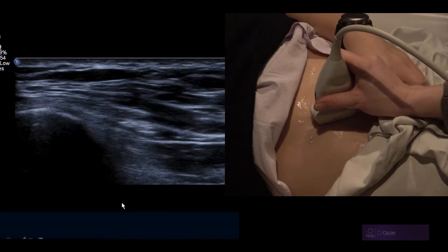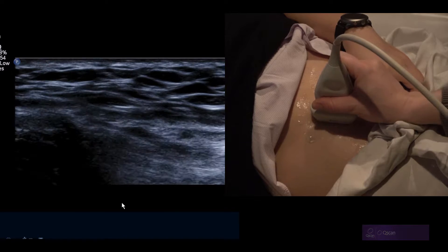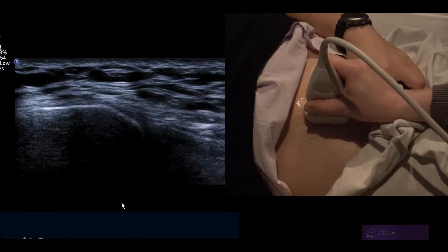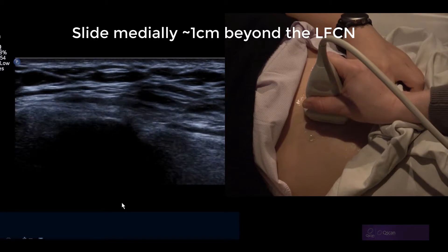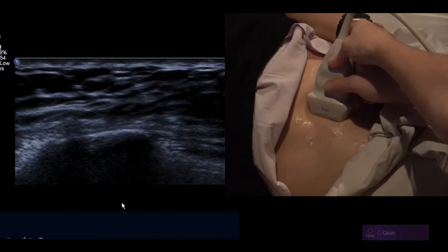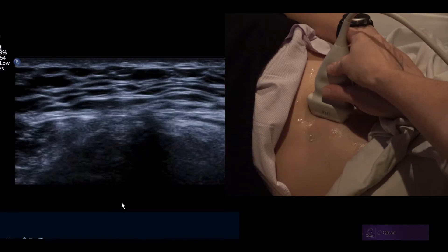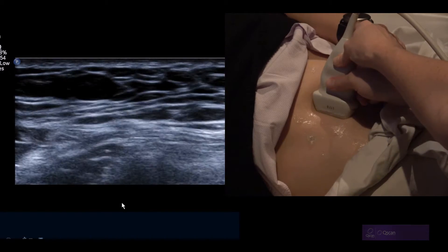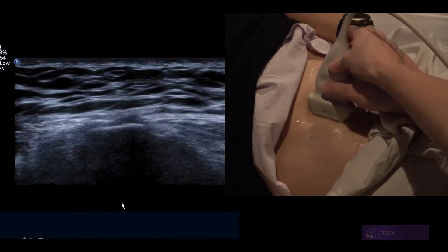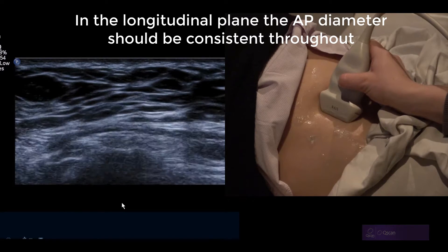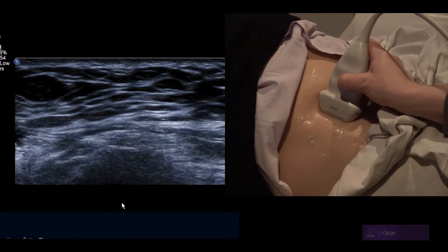We can look at the diameter of the nerve in longitudinal or the cross-sectional area in transverse. In longitudinal it can be very difficult to stay on the nerve. If you put the ASIS in the middle of the probe and then move the probe one to two centimeters medially, then try sweeping out laterally slowly towards the ASIS again — there you can see the nerve diving out from the abdominal cavity and passing beneath the inguinal ligament. It should have a relatively uniform diameter throughout, without fusiform thickening or a nodule. You can see how a normal nerve is very tiny and difficult to appreciate.